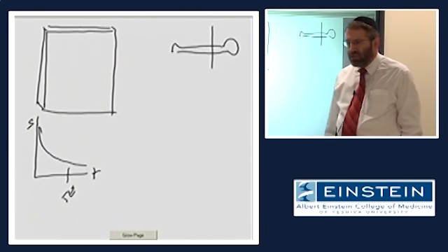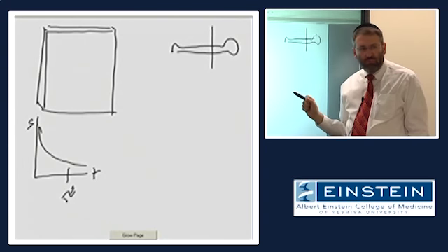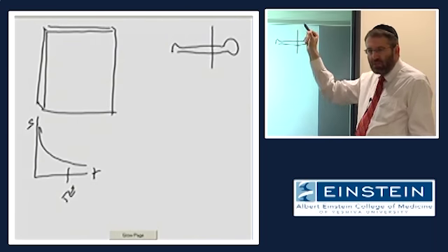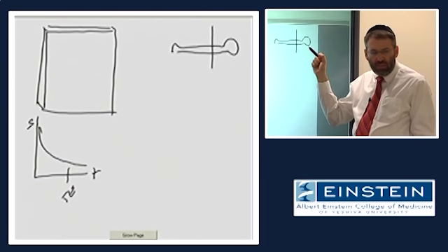So when I measure that signal, where in this slice does it come from? We know that it only comes from that slice because we've used slice selection, as we just described it, to make sure that that's the case.